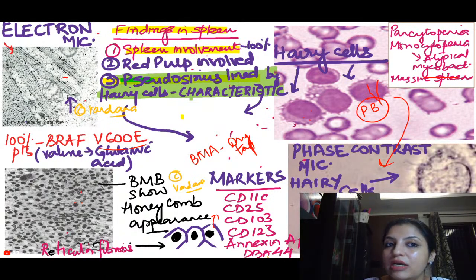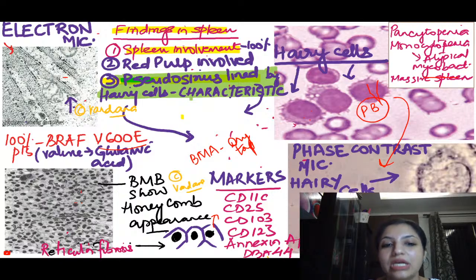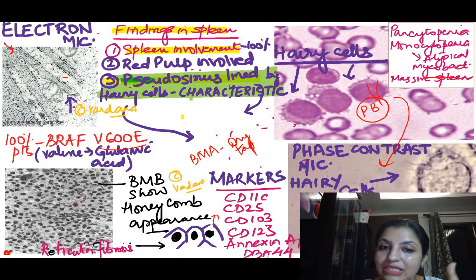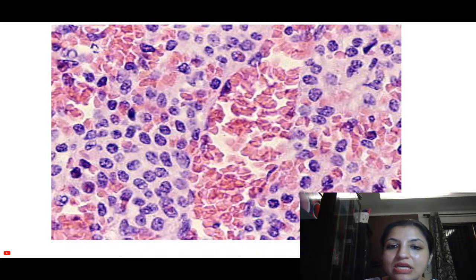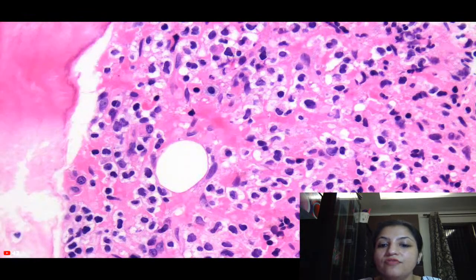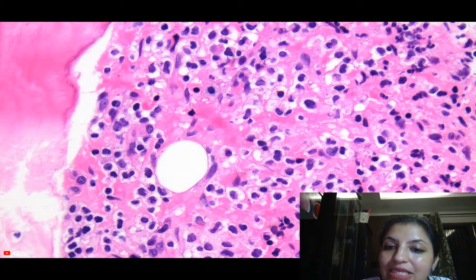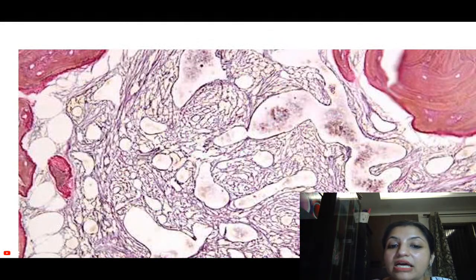Spleen involvement is seen in nearly 100% of hairy cell leukemia cases. In contrast to other leukemias, in HCL the red pulp is involved. A very characteristic finding is pseudosinuses — blood spaces lined by hairy cells. These blood-filled spaces lined by hairy cells are called pseudosinus formations and are a very characteristic splenic finding in hairy cell leukemia. In bone marrow biopsy, all these cells have a clear space around them — this is the fried egg appearance.